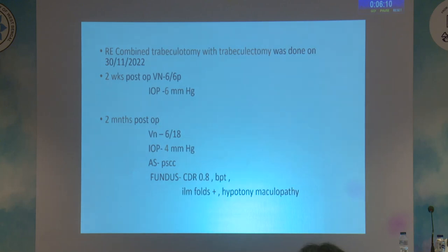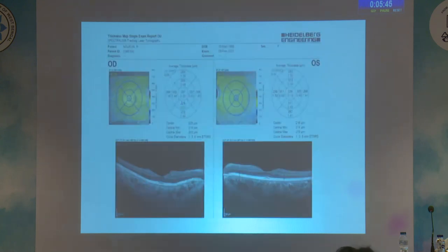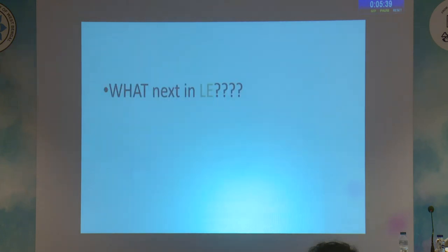The patient underwent right eye combined trabeculotomy with trabeculectomy. After 2 weeks of surgery, the intraocular pressure was 6 mm mercury, but at 2 months postoperative, the intraocular pressure dropped to 4 mm mercury with the patient developing hypotony maculopathy. At 3 months post-op, the intraocular pressure remained low at 3 mm mercury with persisting hypotony maculopathy. This is the OCT picture showing hypotony maculopathy in the patient.